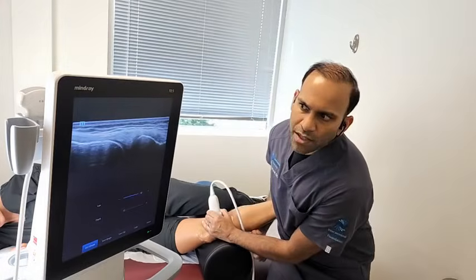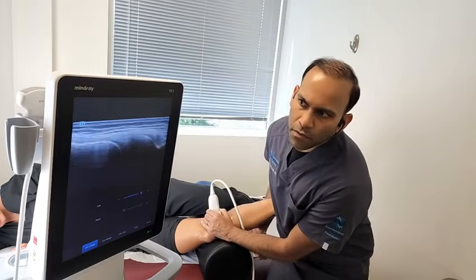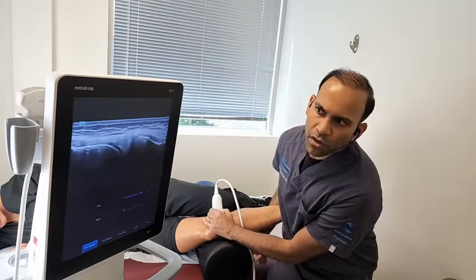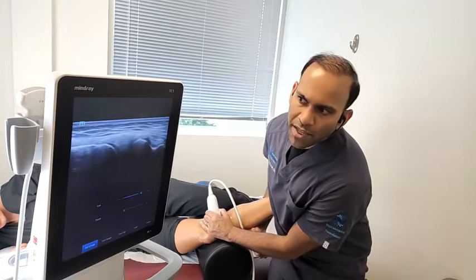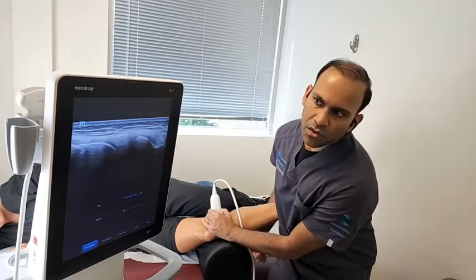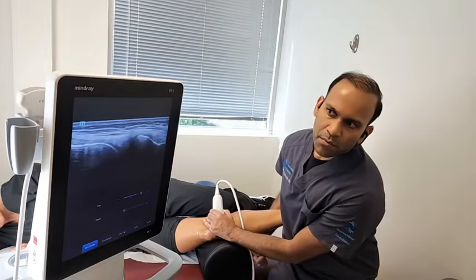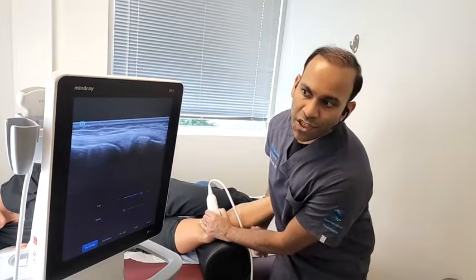Now, this is coming in and out in a pretty decent, pretty normal amount. It's normal for the meniscus to move a little bit. But if there was a major tear, root tear of the meniscus or something that was causing instability, then you'd actually see this meniscus come in and out substantially more.